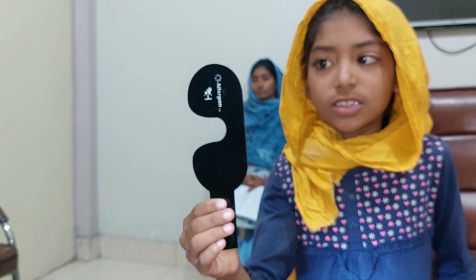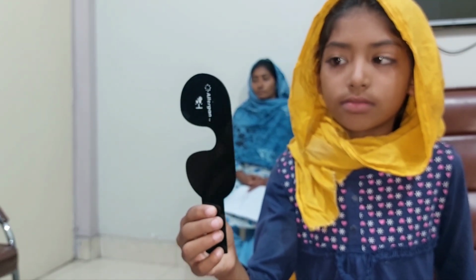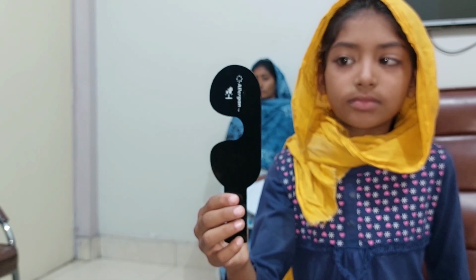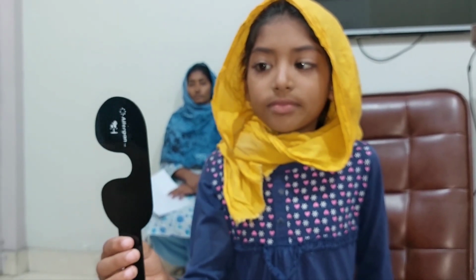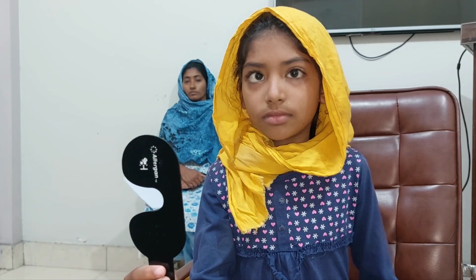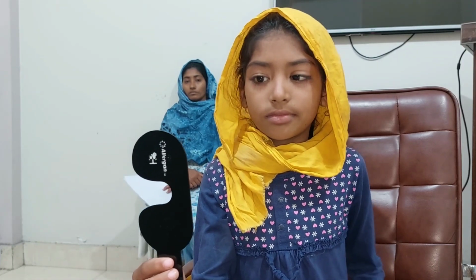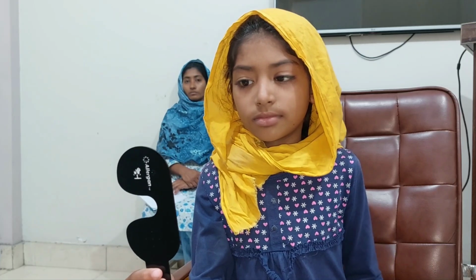The left eye seems to be remaining in the inward direction with an angle of 15 degrees; it is not fixating centrally. You are noting that the patient is gradually shifting to abnormal head position. The face is turning towards left so that the left eye becomes adducted and the two eyes are straight. To avoid diplopia, the patient is turning the face to the left.